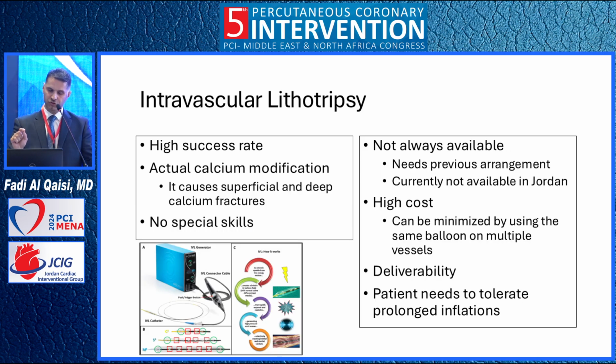Intravascular lithotripsy. This is the new invention. It's beautiful equipment. It has a high success rate. It's actual plaque modification, calcium modification. It doesn't need any special skills, actually. It's not always available. Until now the agent still hasn't brought them to us again. It needs previous arrangement. It needs high cost.